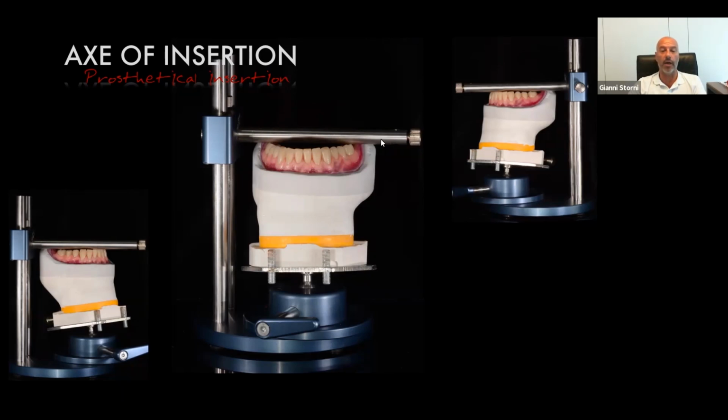Using our articulator, which is a small multi-use articulator, we control the occlusal plane and, following this occlusal plane, we have to position the attachment correctly to have a passive and vertical insertion. And this means long-lasting retention and good distribution of the forces.